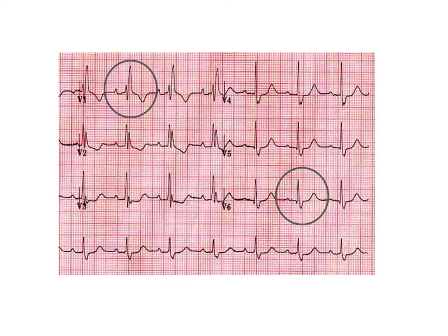Here is an EKG of a typical right bundle branch block. In leads V1 and V2 you see the typical R, S, R prime pattern. In V6 you see the Q wave from septal depolarization with a large, tall R wave, and then the widened S wave at the end significant for right ventricular depolarization.